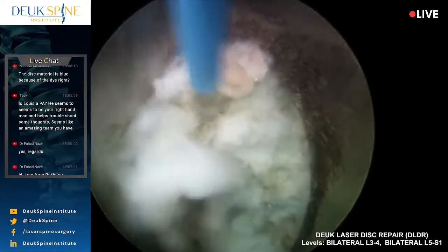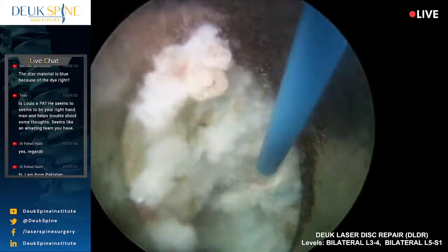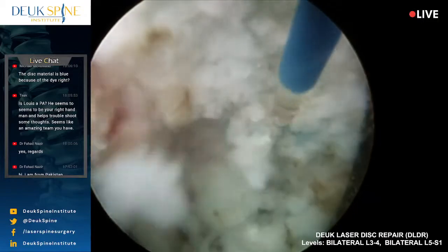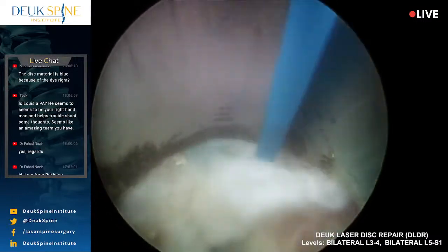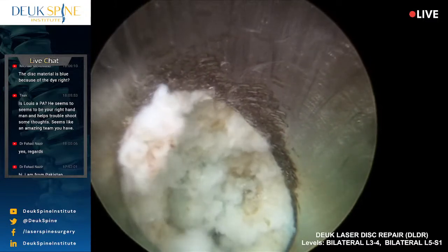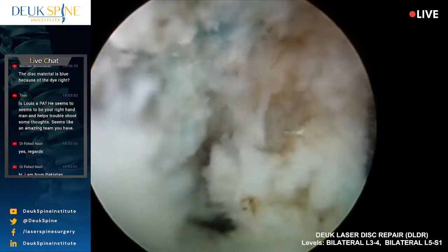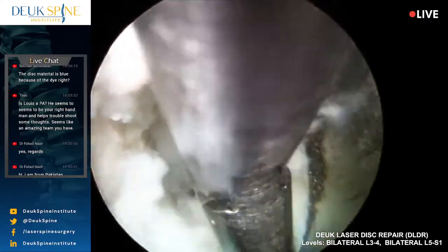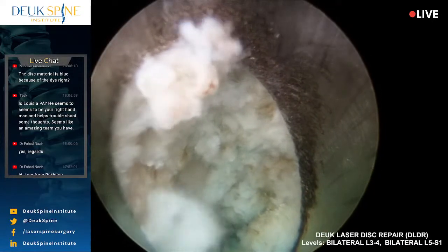Doc? Yep. I don't know if you want him that late. I'm okay. All right, that's fine. You're almost done. No, I'm almost done with this disc. I still have one more. This disc is a never-ending disc. Just lay still, you're doing good. I've never seen that, 100 fragments of disc. Let me know when I can proceed.